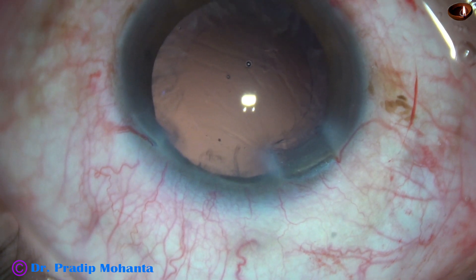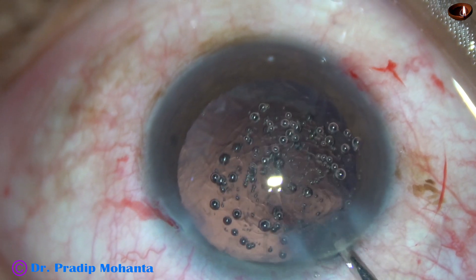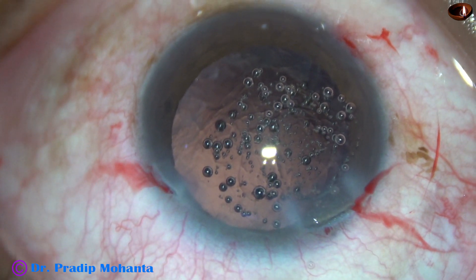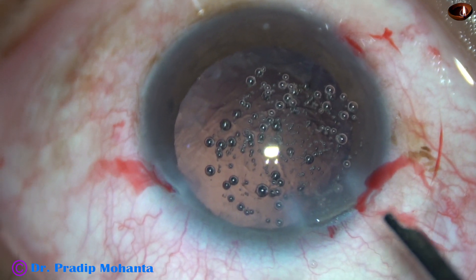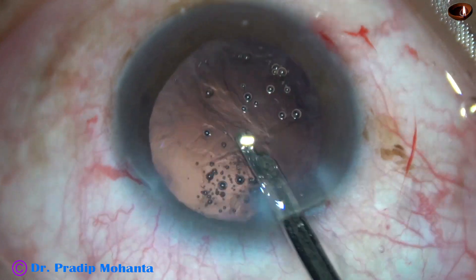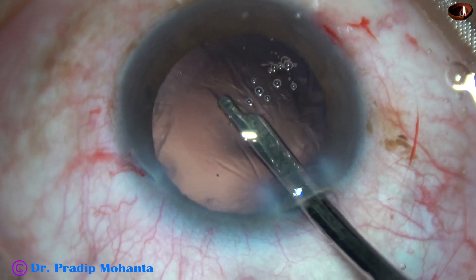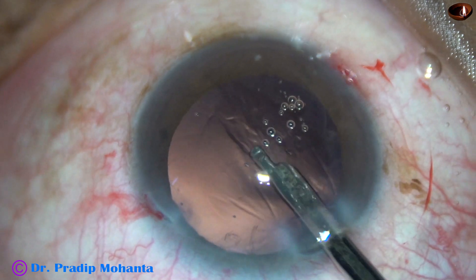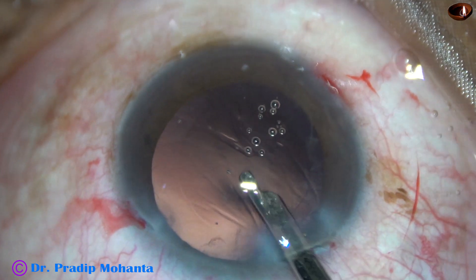Now I am going to use a 23G Simcoe cannula to remove cortex from the lower part, from 4 o'clock to 8 o'clock. This is the cortex from 6 o'clock, and this is from 5 o'clock and 4 o'clock. This Simcoe cannula is a very safe and very gentle instrument for removal of cortex.